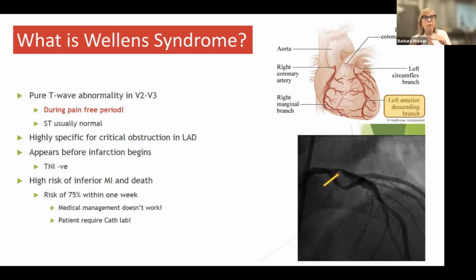STs are relatively normal. It is highly specific for critical, life-threatening obstruction in the LAD. So whoever made sure that cardiology took a look at this EKG, bravo, fantastic. And also, you're going to see this appear before you are actually having significant infarction.